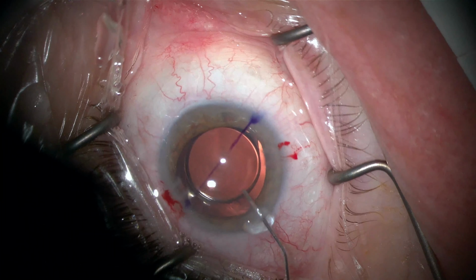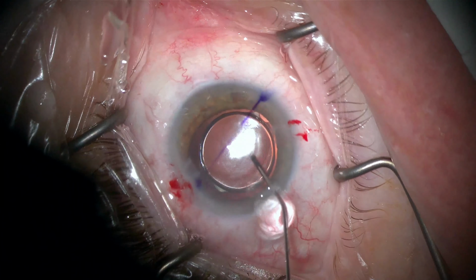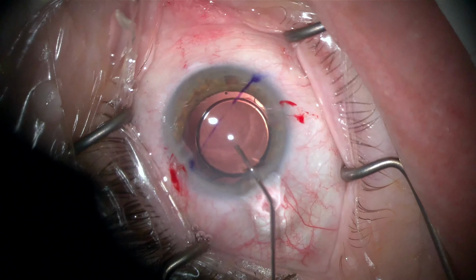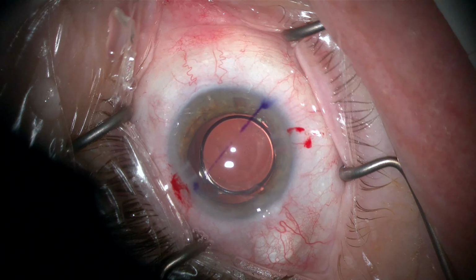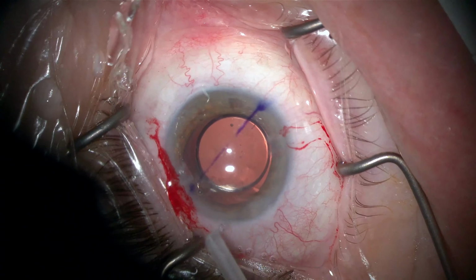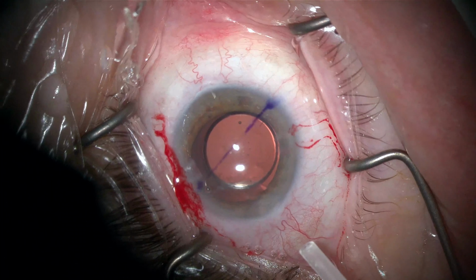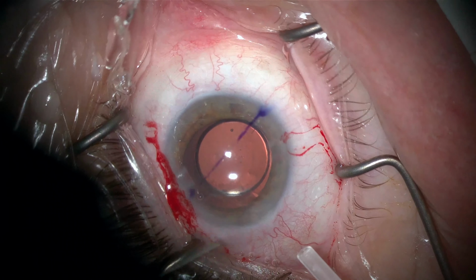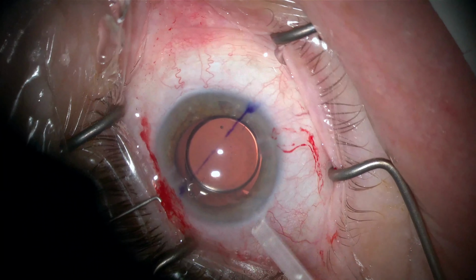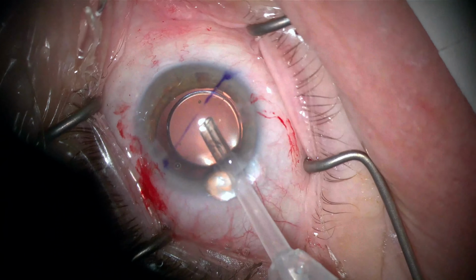And typically I do not use a capsular tension ring routinely with my toric cases, but in this case I felt that this rotation may have occurred due to a large capsular bag, especially given the longer axial length in this patient. So I wanted to do anything possible to prevent further rotation and really keep the IOL in proper position.